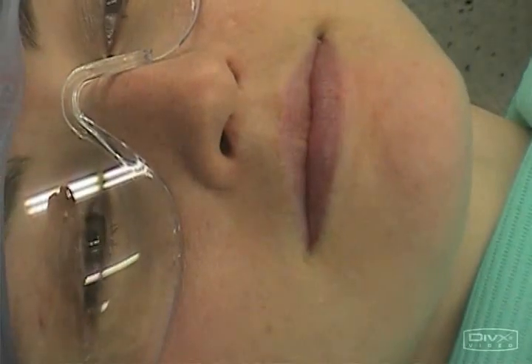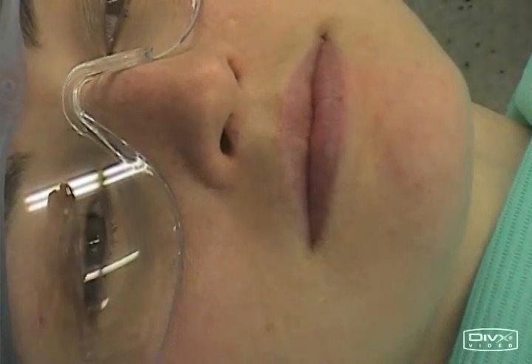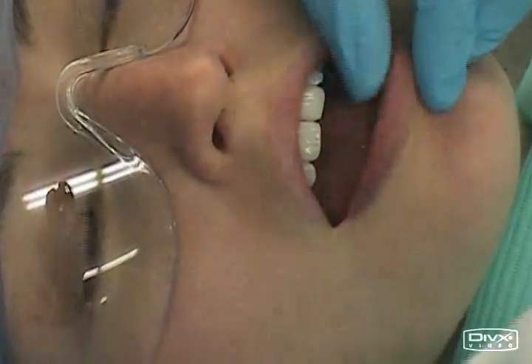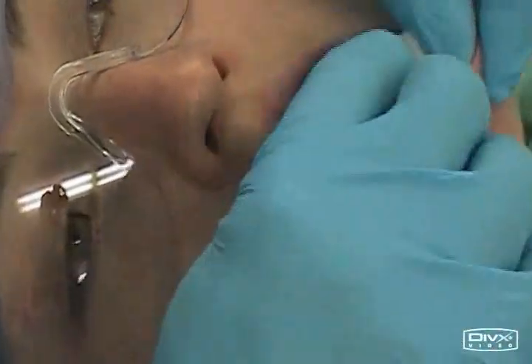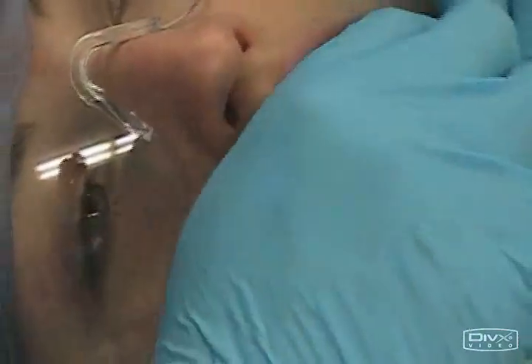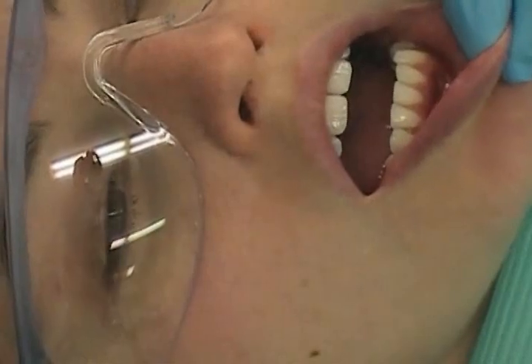We're going to do an infiltration on the 23-24 area. The nerves are the long terminal branches. The areas to anesthetize for the maxillary is the pulp, soft tissue, and bone in the area of the injection.